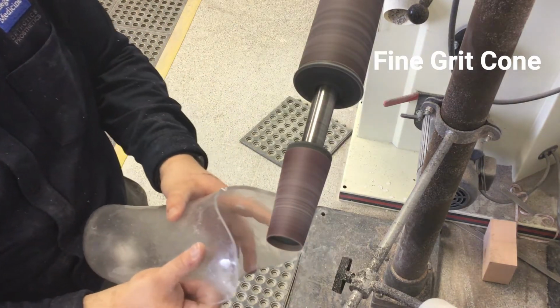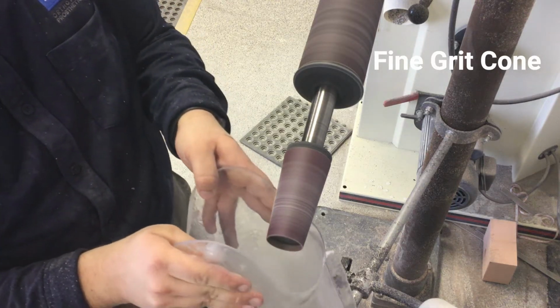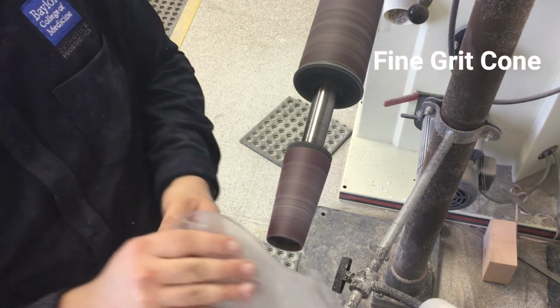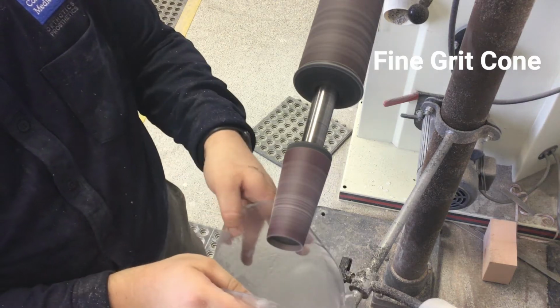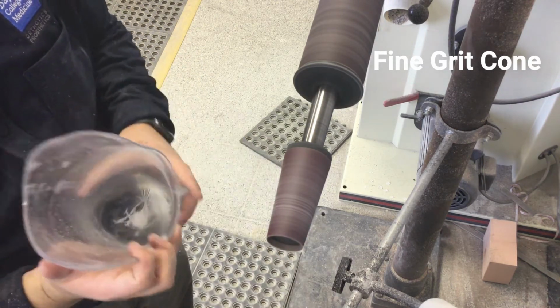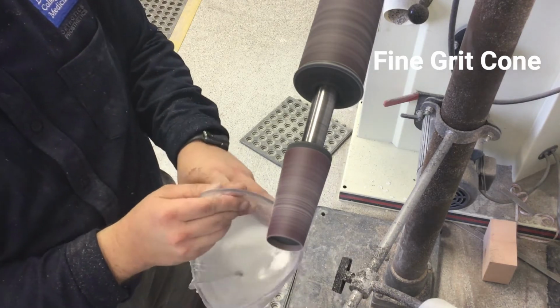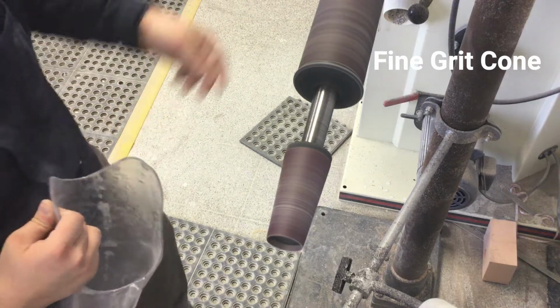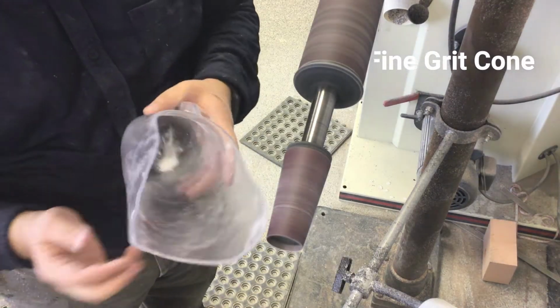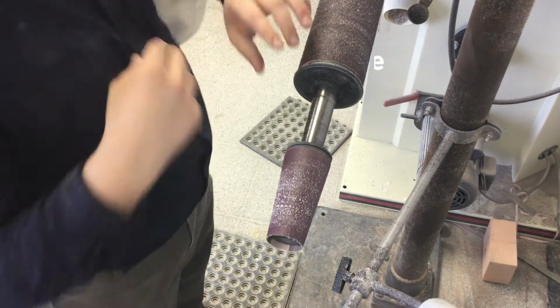You can check your progress on making that gradual transition by running a finger along the edge, as seen in this video, to ensure you are making the correct transition. This process makes a nice gradual transition from the inside to the outside of the socket without any sharp edges to hurt the patient.